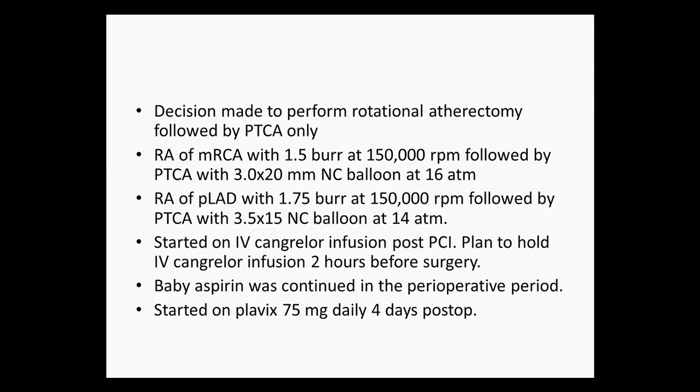So let's see what you do. We actually decided that we would perform rotational atherectomy and PTCA only of both the LAD and the RCA. Let her undergo the surgery because it was time contingent, and then have her come back whenever she's stable post-op. It's best to not stent those lesions.